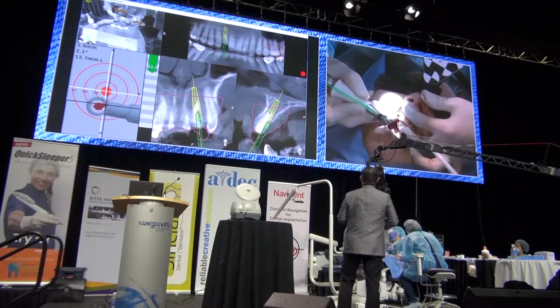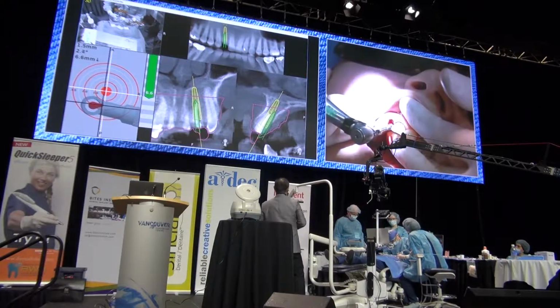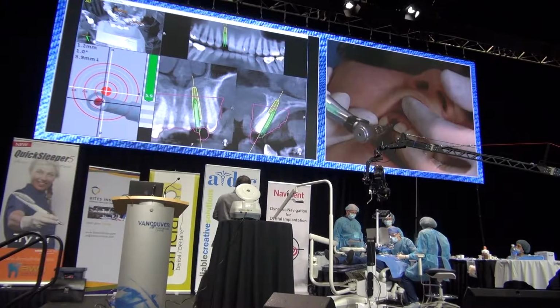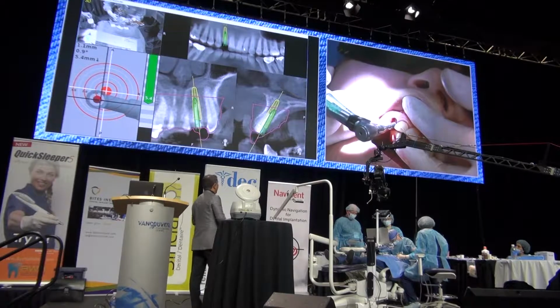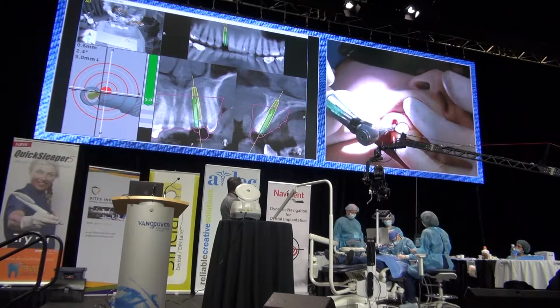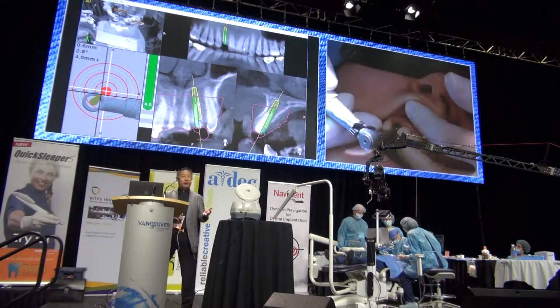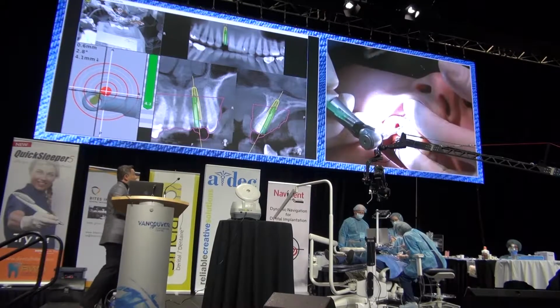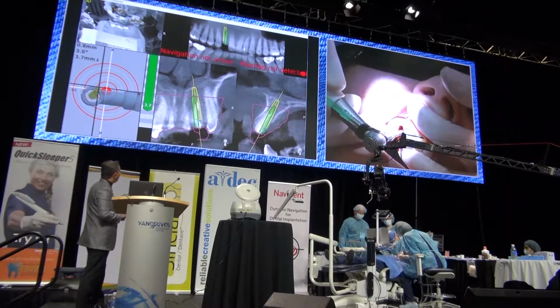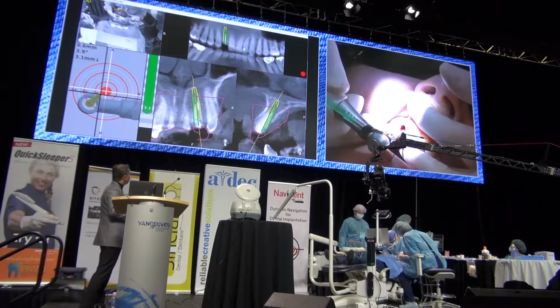So I tell the patients, we're going to go ahead and put the implant in. The implant is going in and we're looking to lock in with primary stability. Again, we appreciate the lack of density in this bone. With a Hounsfield of 200 or 300, it is probably D4 type of bone. So in the osteotomy, the preparation is very important to undersize.